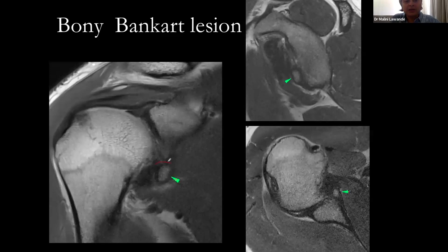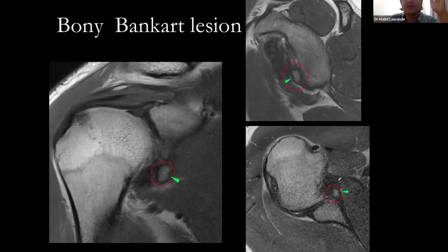Non-fat-saturated images like T1 or PD show the bony Bankart osseous fragment very well. T2 fat sat produces a lot of edema that confuses things, so non-fat-sat sequences — T1 or PD — are preferred to show the osseous fragment, assess its dimensions, and determine whether it is significantly displaced.